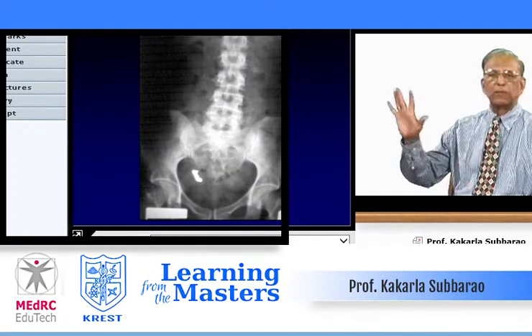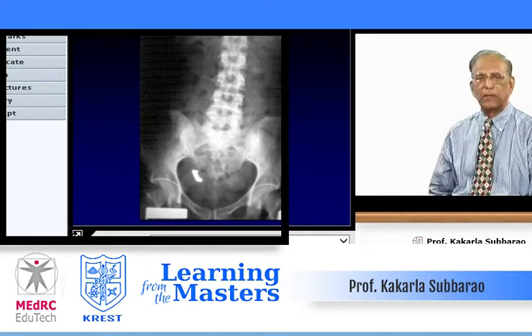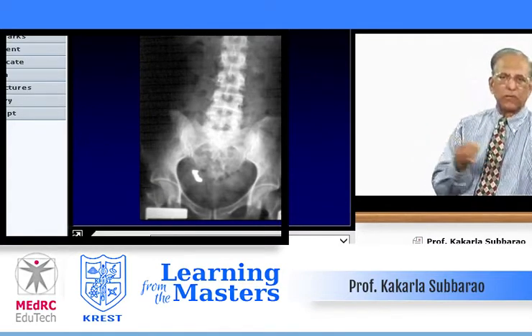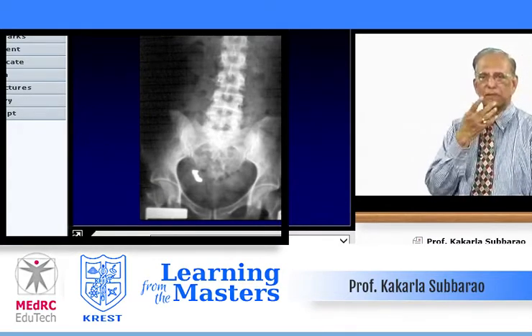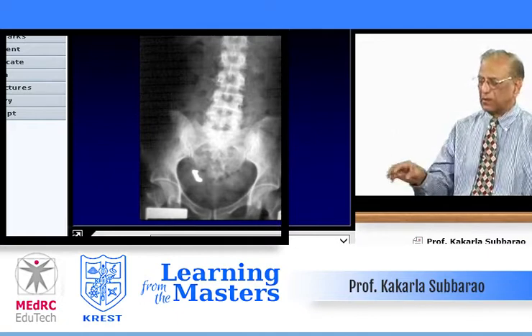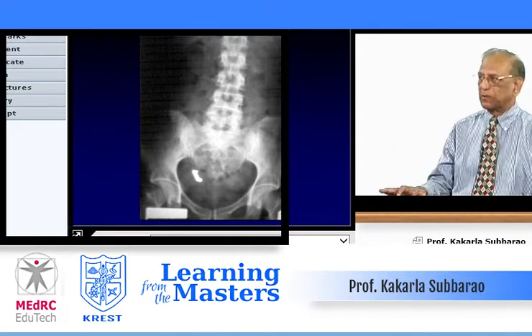So you take a preliminary film. You find a radiopaque foreign body in the pelvis. This patient had no teeth. His son, who was studying in America, came one day and said, "Why don't you have dentures?" He took him to town, and a dental surgeon fixed some dentures. Unfortunately, while eating, he swallowed the dentures, and this is the denture set, producing pain and mild obstruction.